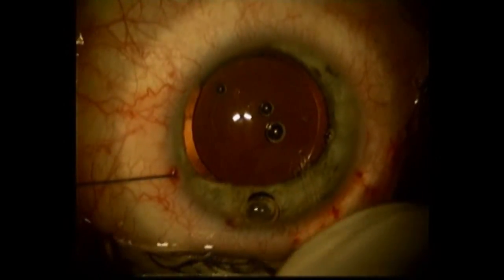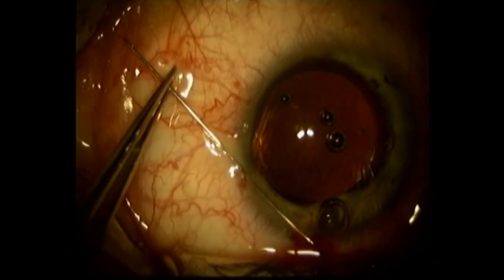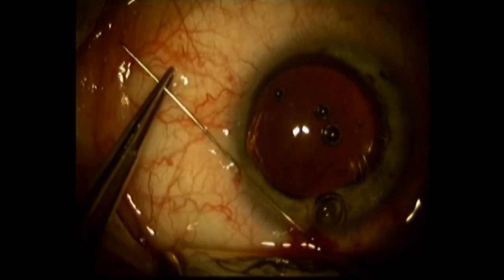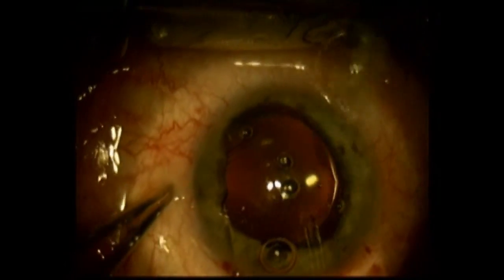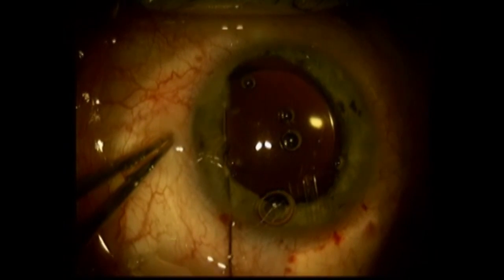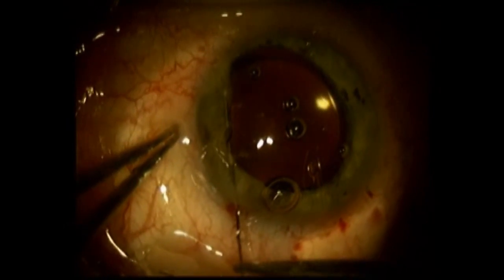I'll create an opening here so I can retrieve the needle and just continue this purse-string effect. Just getting the edge of the iris here.